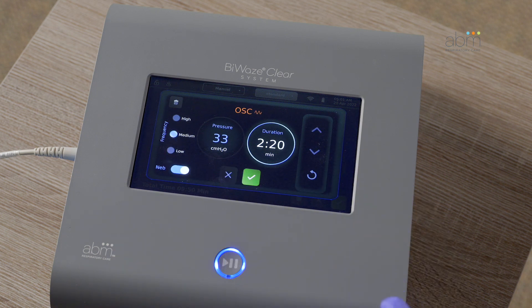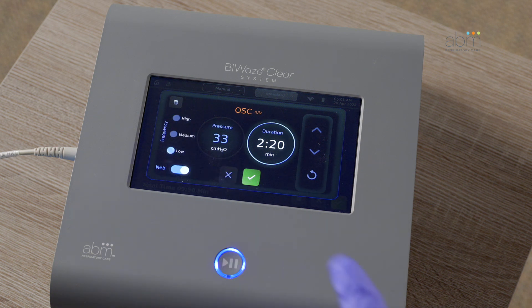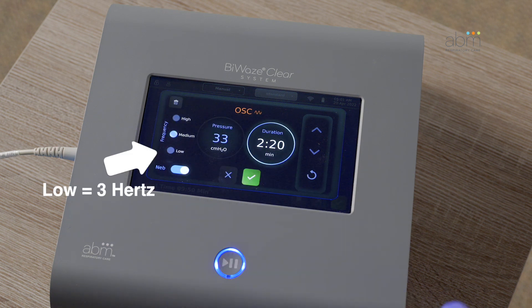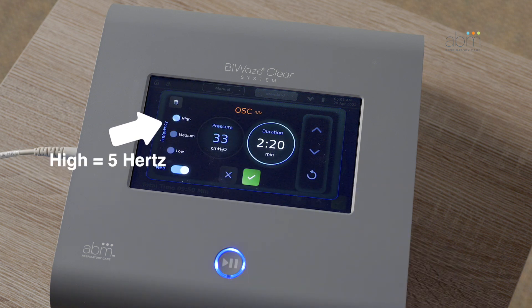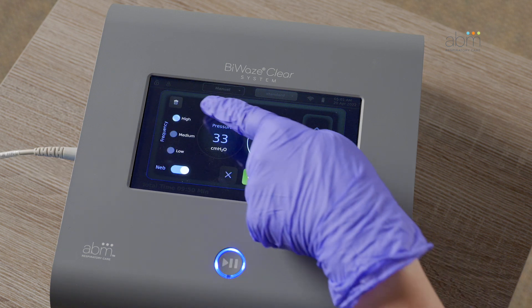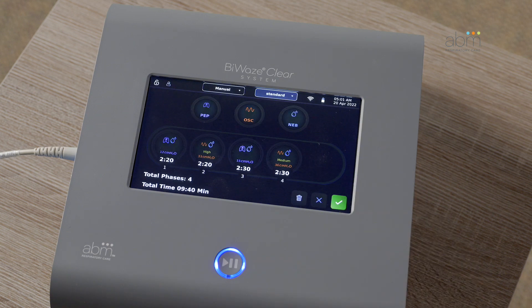The radio buttons allow you to select the frequency of low, medium, or high oscillations. Low is 3 Hz, medium is 4 Hz, and high is 5 Hz. The trash can icon will remove the phase. Press the check mark to save the changes to the setting.